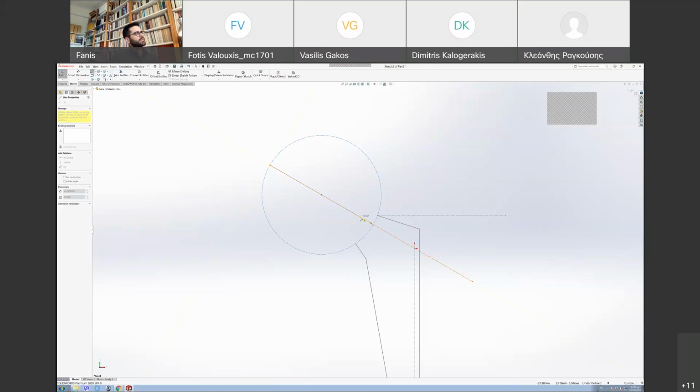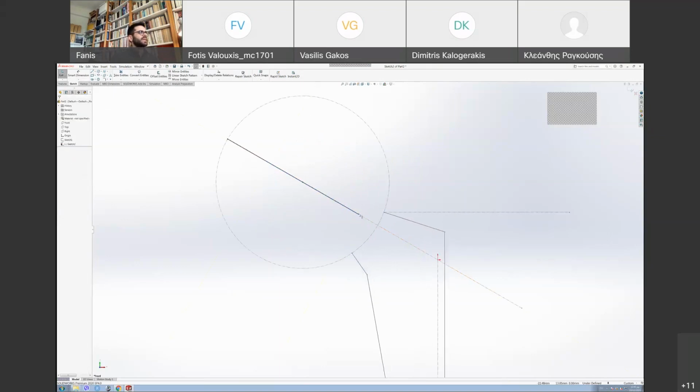Okay, again, now make sure you don't leave any gaps here because SolidWorks can be tricky with very little gaps. If you leave some very tiny gaps, it might say that it can't extrude the boss or create a solid out of it because there are gaps, and it's really annoying sometimes. So make sure the points and the end points are all correct.